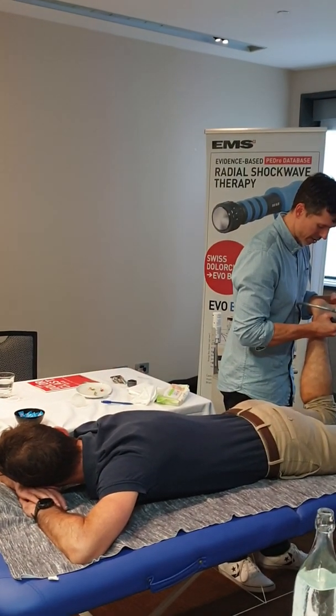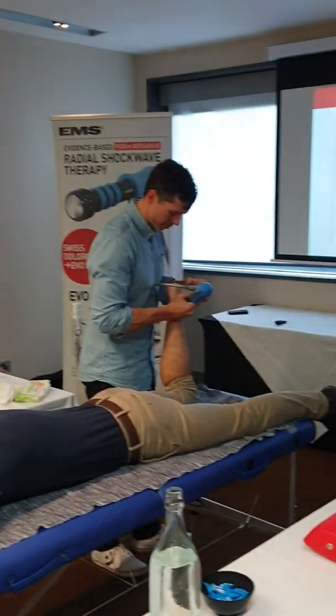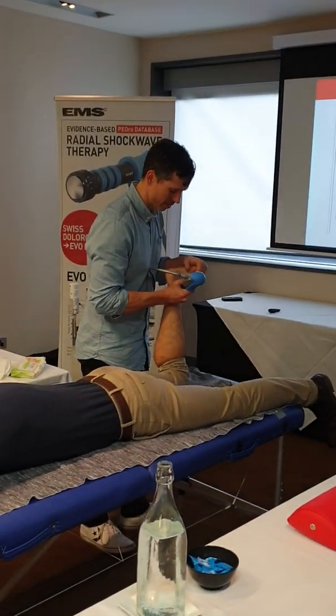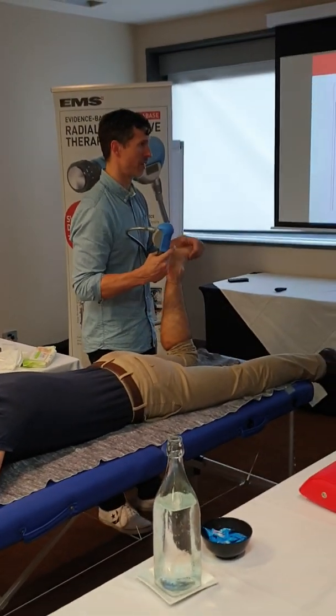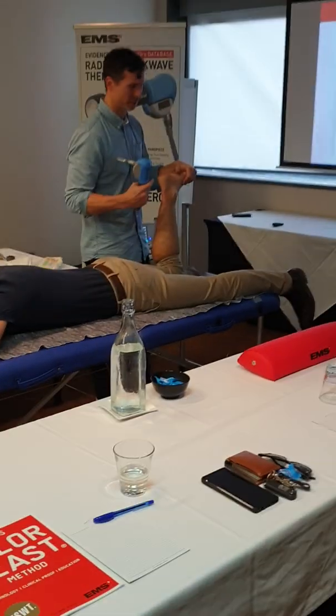Yeah, the dark gray outer and the silver part inside. That just fully let go. I could just feel his dorsal deflection increase like 5 degrees as soon as that's fully let go. Feel that move more?